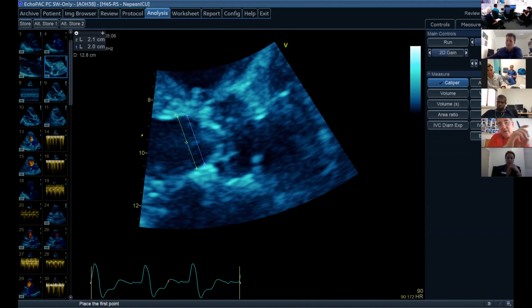You have to pull back your. It more accurately represents where we tend to put the. Sometimes the valve leaflets are so heavily calcified, it's quite hard to see where the insertion points are. I was going to say exactly that. They're all valid. Yeah, it's one of those minor debates in medicine that goes on forever. And that's why Malcolm is correct. I think if you can have a debate on it, then you know your stuff.